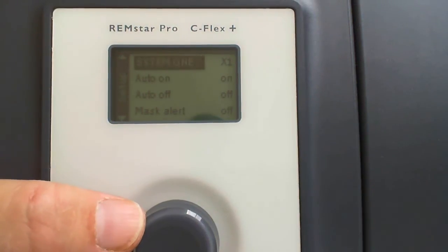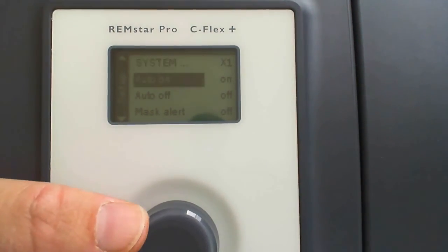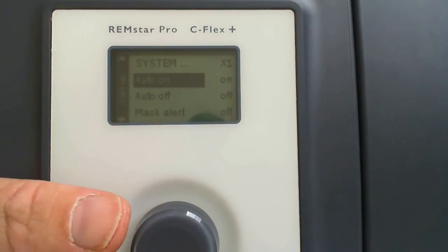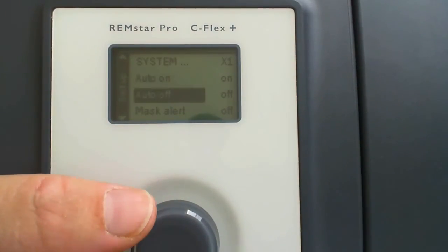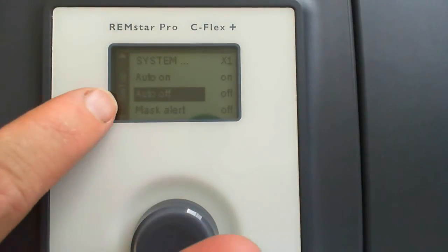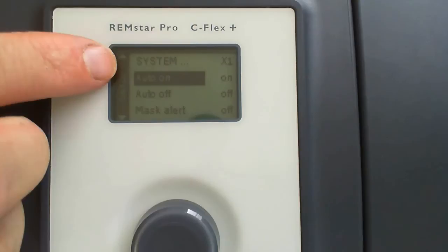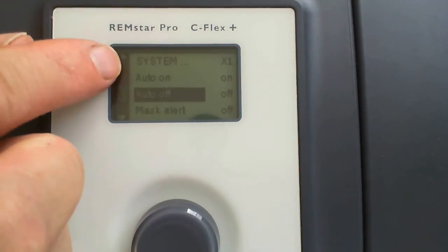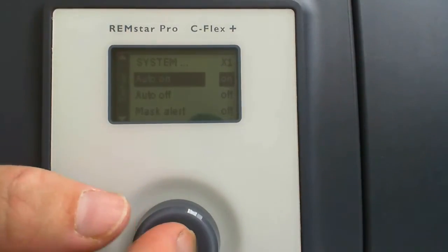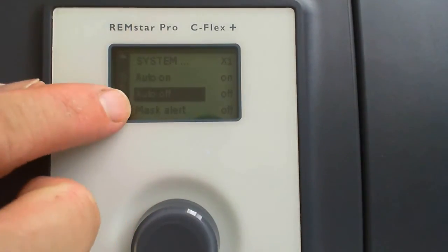I know with the M's, I give it 10 breaths, and then I have to punch the button, and it was off underneath my night table at the time for the noise factor, and that was a real pain. I really like this feature. Didn't work so well on the M's. Up here on the System Ones, this is a lot more sensitive. I can get 2 to 3 breaths in, and it'll turn on for me. So I do want to leave that on.